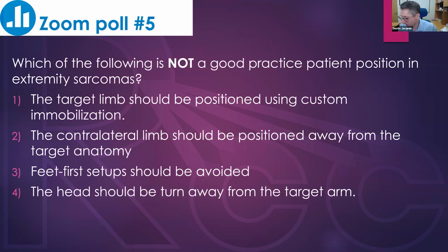Minsun, do we have any questions? Well, I think people are still discussing SBRT spine. Oh, okay. It's a good topic. So do you know if we can re-irradiate spine with SBRT? Have you ever seen re-irradiation of the same spine?